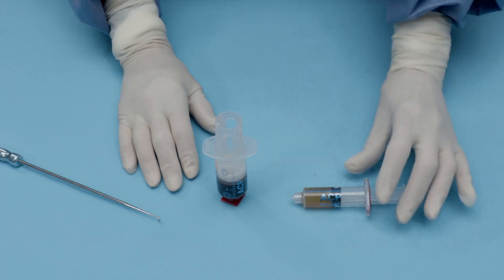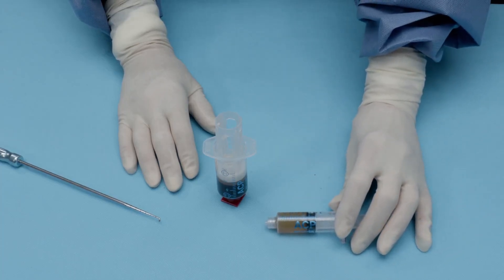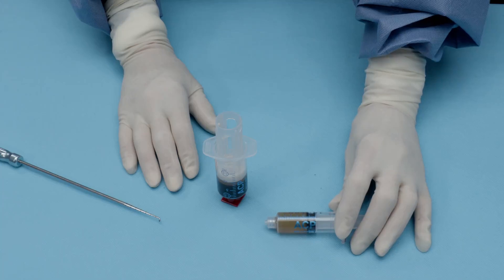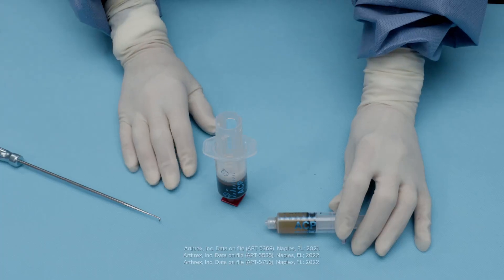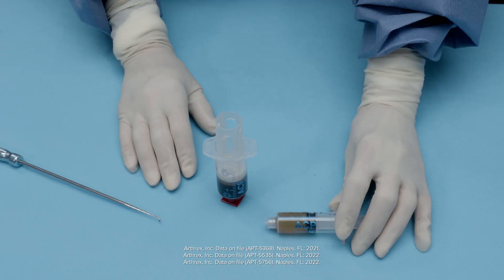The ACP Max device allows you to process 30, 60, or 90 cc's of peripheral blood for a final ACP Max product that ensures a high platelet and low neutrophil final product for use. This can all be done in a very efficient workflow manner.